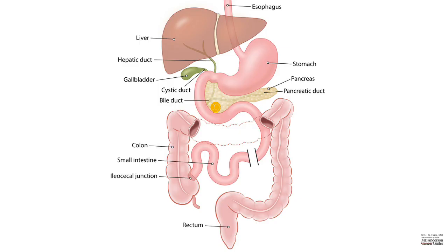So, let us see. Here is a mass in the pancreas that you can see. So, you pass the linear EUS scope down the mouth, pharynx, esophagus, stomach and duodenum, and once you find the mass under ultrasound, the mass is located in the pancreatic head. So, you decide to biopsy, you pass a needle and under ultrasound guidance take tissue. That is how we use the linear EUS scope.